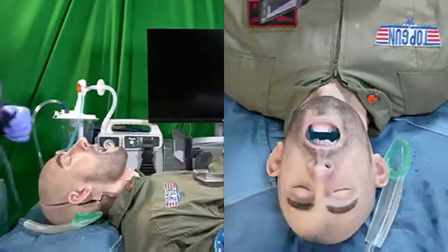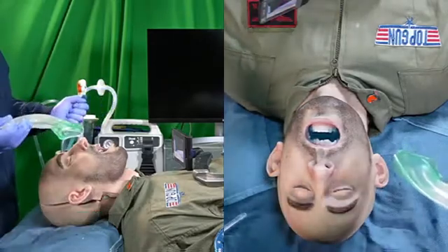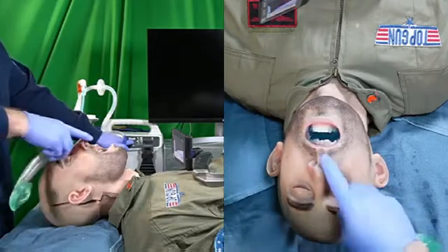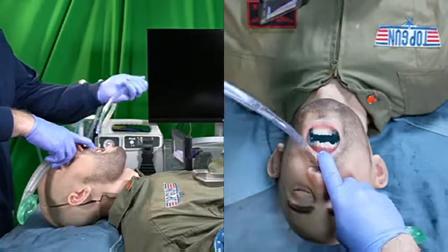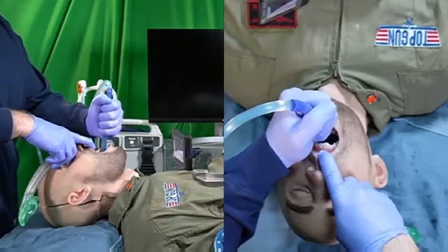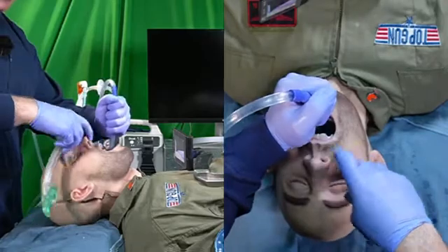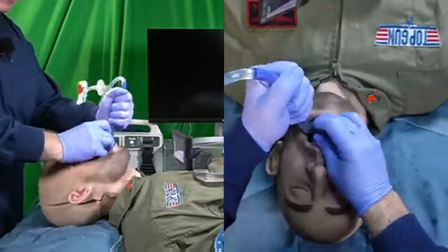I'm going to demonstrate the use of the suction-assisted supraglottic airway insertion in the setting of a contaminated airway. Our mannequin here is full of simulated airway contaminant. I'm going to turn on my suction, and what I'm going to do is decontaminate the oral pharynx and then the hypopharynx. And then I'm going to compress the tongue into the floor of the mouth, lift the tongue off the posterior pharyngeal wall, and place my supraglottic airway.